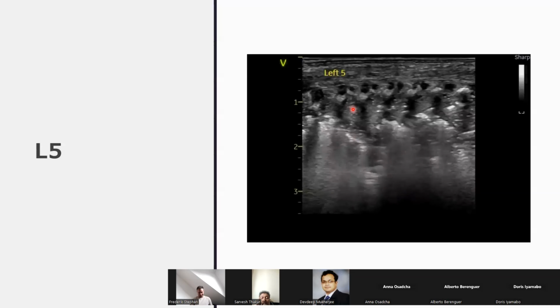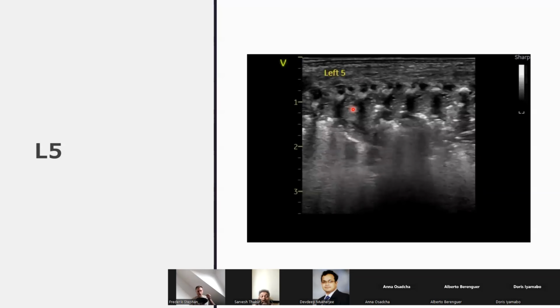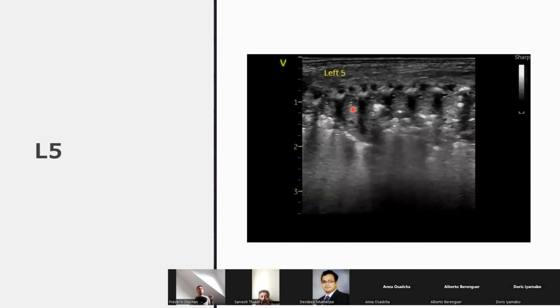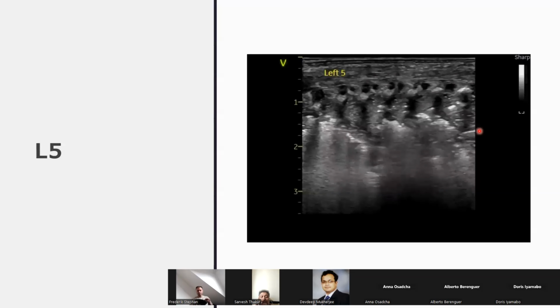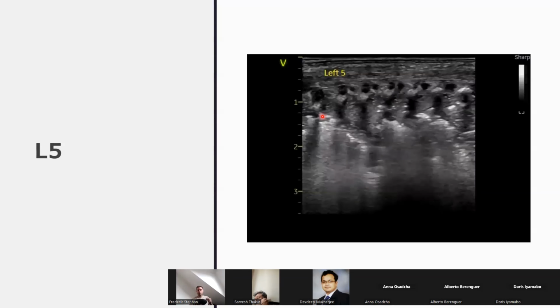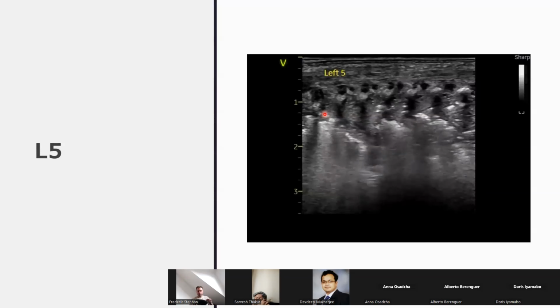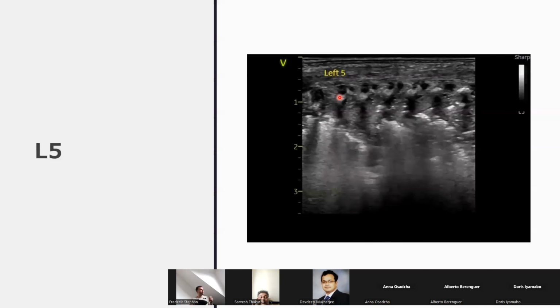An S pattern, as I'll demonstrate in two very small studies done by Chioma et al., reflects a sign of recruitability. Now, what we know is that these horizontal static air bronchograms tend to be present mainly with atelectasis as opposed to pure consolidation. They may or may not reflect lung that's recruitable. Eventually, what will tell us whether this lung is recruitable or not is actually performing the recruitment maneuver.